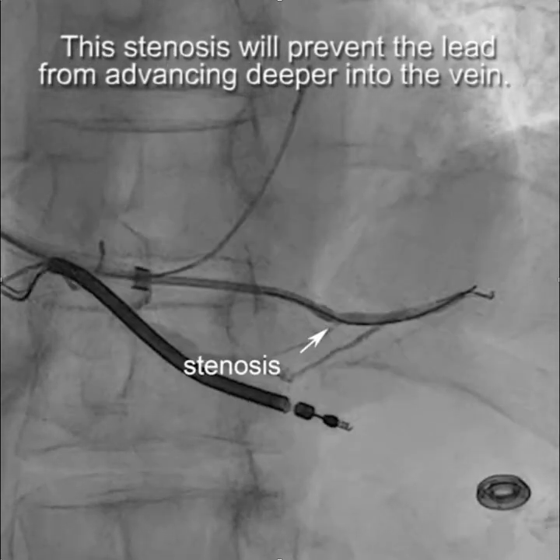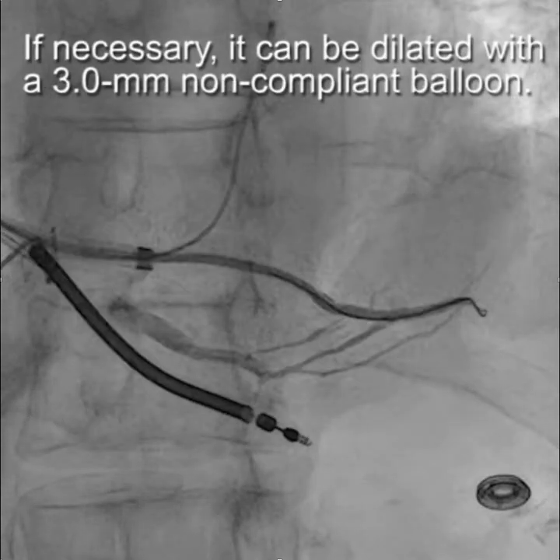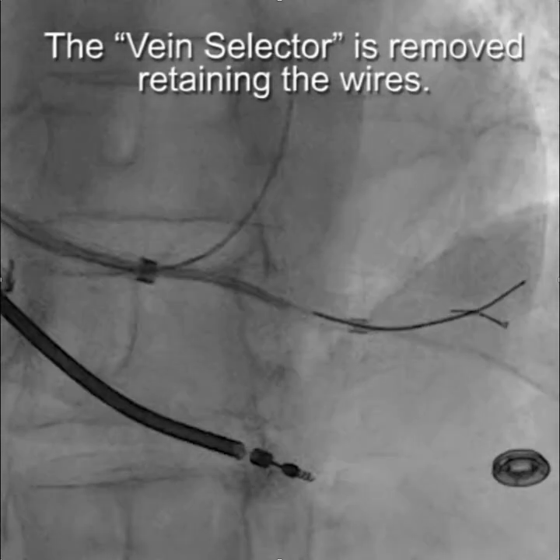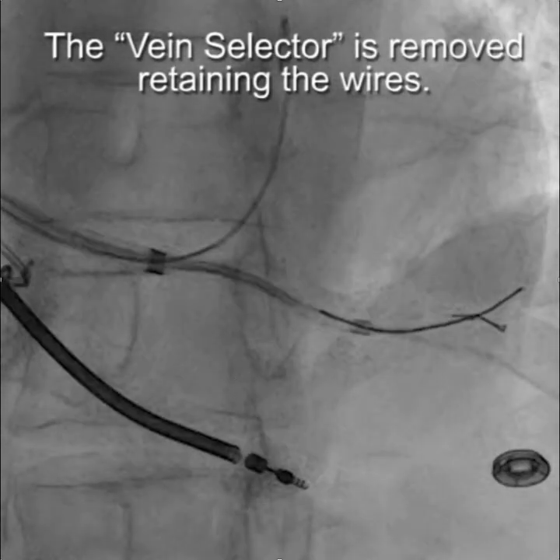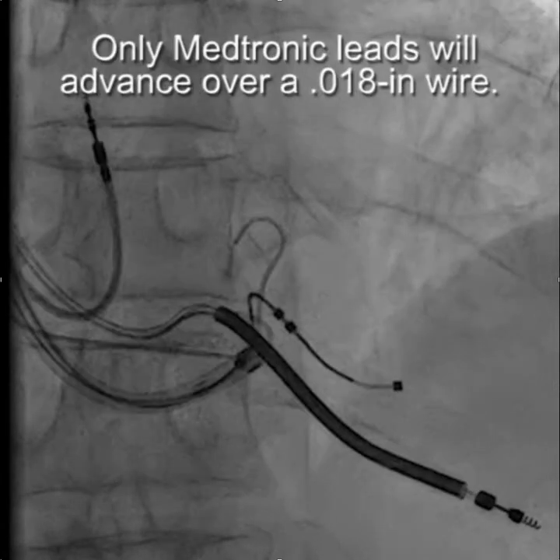When you inject contrast, you can see there's a bit of residual stenosis, and ultimately this made it impossible to advance beyond that point. If necessary, we could dilate that with a three millimeter non-compliant balloon. The vein selector is removed, retaining the wires. Then the 0.014 inch wire is removed, and the LV lead is advanced over the 0.018 inch wire.